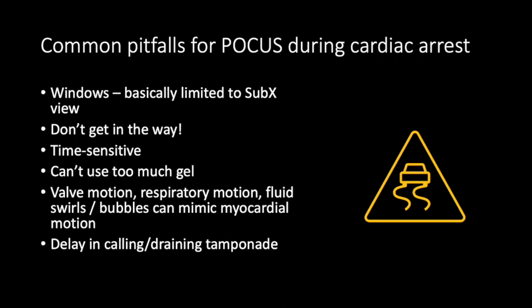This is not the time when we're going to be taking complex views, using the parasternal long axis view, and rotating to get all the views of the PSAX. No, we are just there to see if the heart is functioning properly or not, see if there are big effusions or not, and help determine rhythm when we can. This is a time-sensitive exam, so it should be performed by the most experienced point-of-care ultrasound provider in these settings, or at least that person should be on hand to help direct learners.